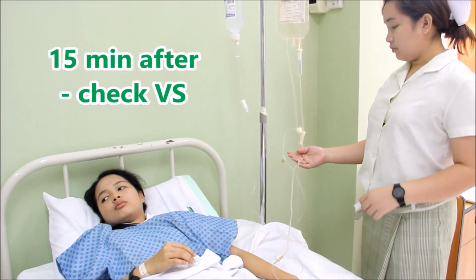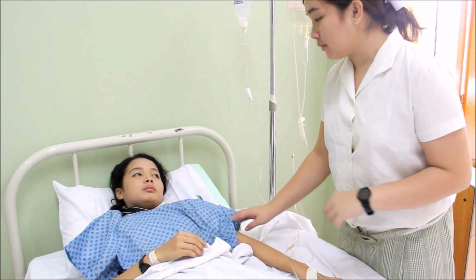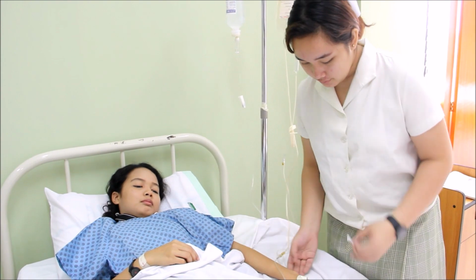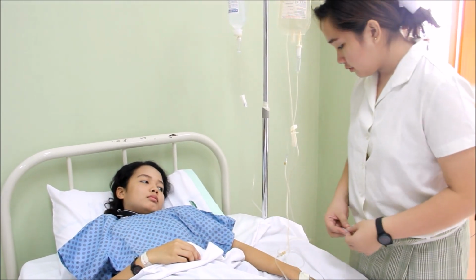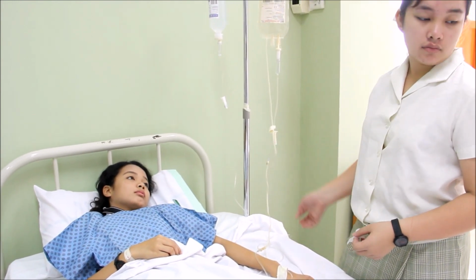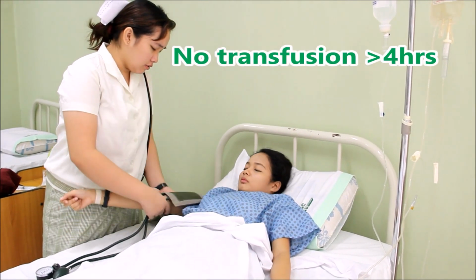Fifteen minutes after initiating the transfusion, check the vital signs of the client. If there are no signs of a reaction, establish the required flow rate. Most adults can tolerate receiving 1 unit of blood in 1.5 to 2 hours. Do not transfuse a unit of blood for longer than 4 hours.